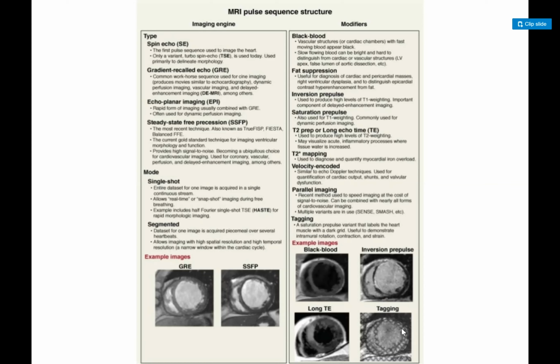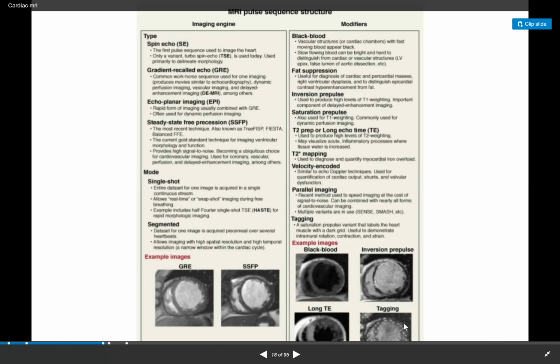There's a very nice case from last Friday. Dr. Orijama told me about that case where the pericardium is adhered to the myocardium, and you can see that the myocardium is not really contracting, and this tagging really accentuates it. You can see it very clearly. So that's what tagging is.